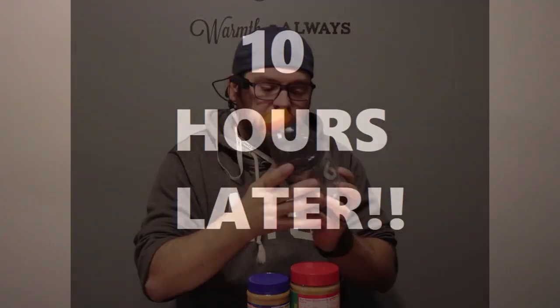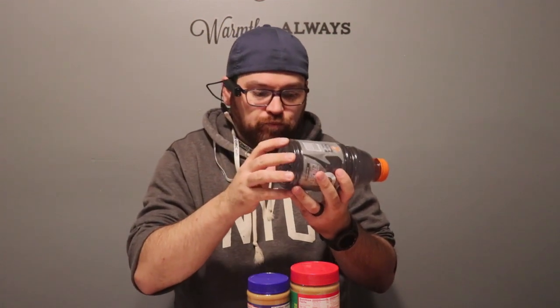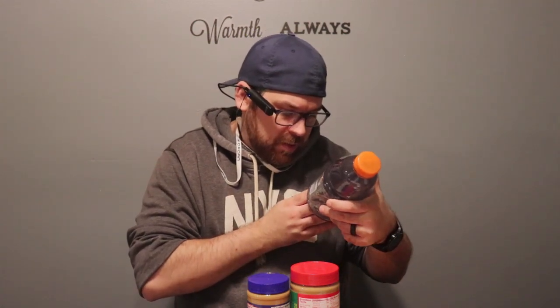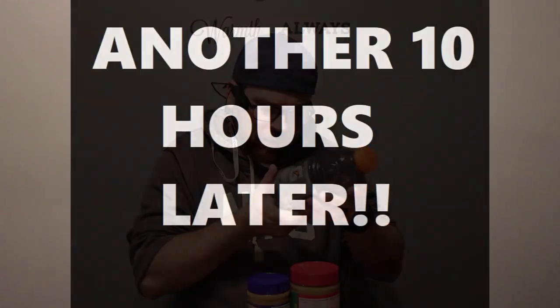And, well, that could be a challenge. 10 hours later. So I'm placing the bottle about a foot in front of my face. I have it in a spot where I'm pretty sure the camera's going to see it. And I found the barcode, and I'm going to point at the barcode. Come on. Oh, I'm not at the barcode. Blind moment.